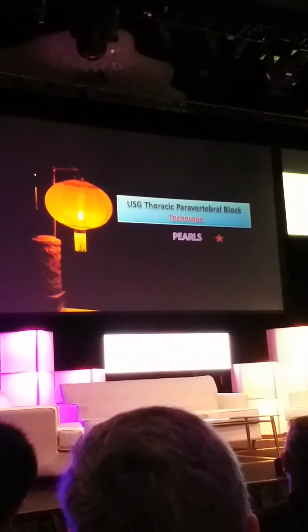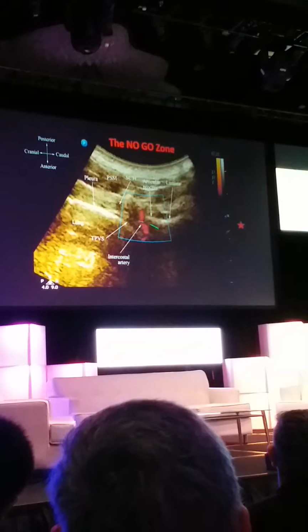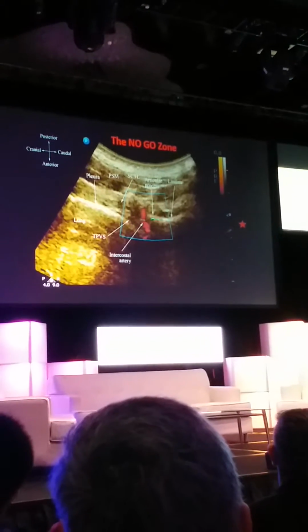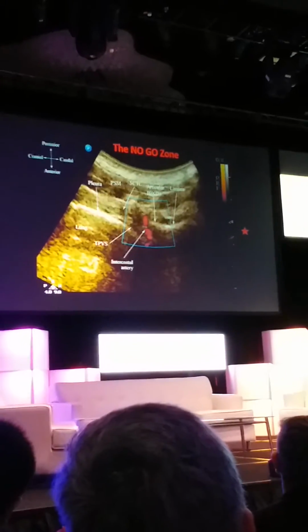So the point for you is that if you're performing ultrasound-guided paravertebral blocks, then you have to remember that although the inferior articular process, as I've shown you, is quite a favorable location, because of its close proximity to the intervertebral foramina, we consider this a no-go zone.